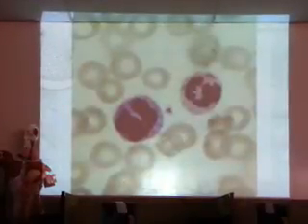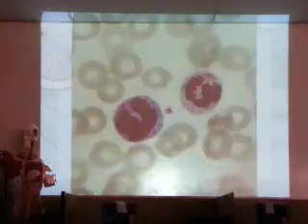Now how about this cell here? Is it a granulocyte or not? It's not? Then you have two choices: is it a monocyte or a lymphocyte? How many say mono? And how many say lymph? It's actually a mono. Remember, lymphocytes have round nuclei. Monocytes have irregular nuclei like that one, and it's huge. On this side is a segmented neutrophil on the right side. This one is fine.